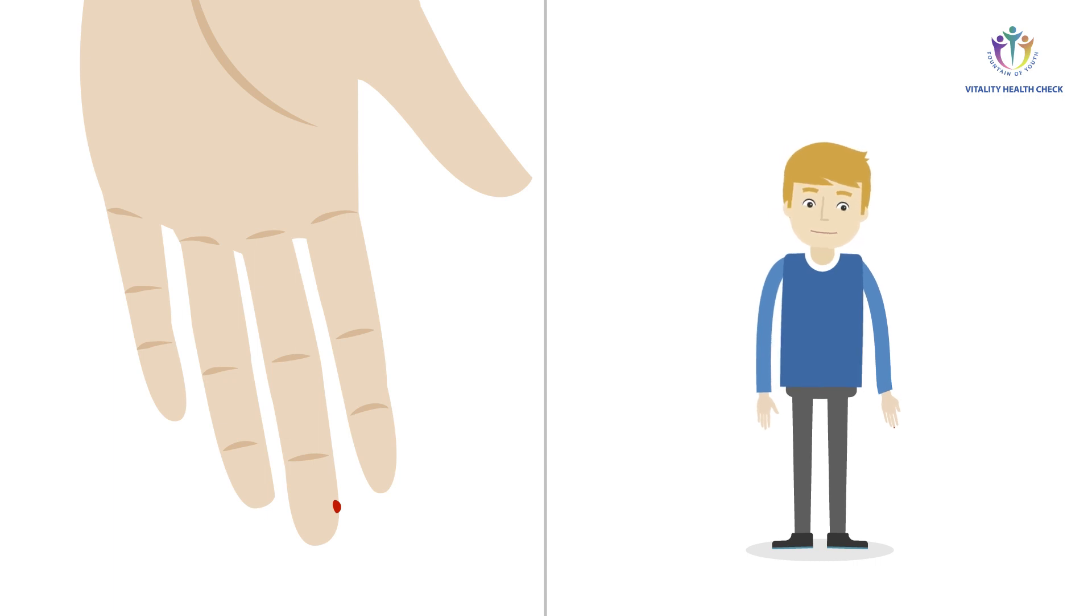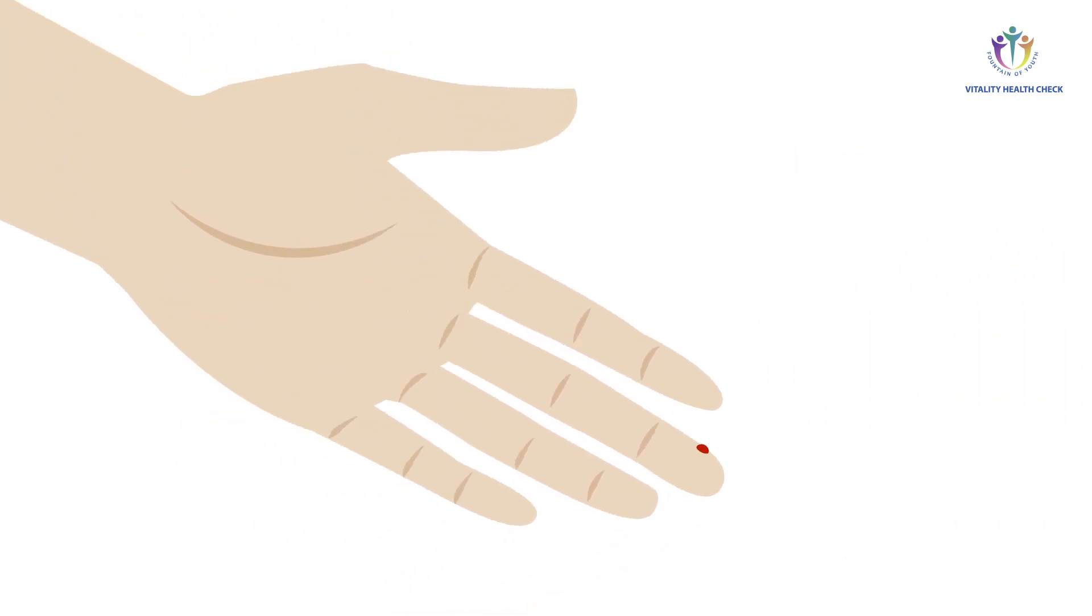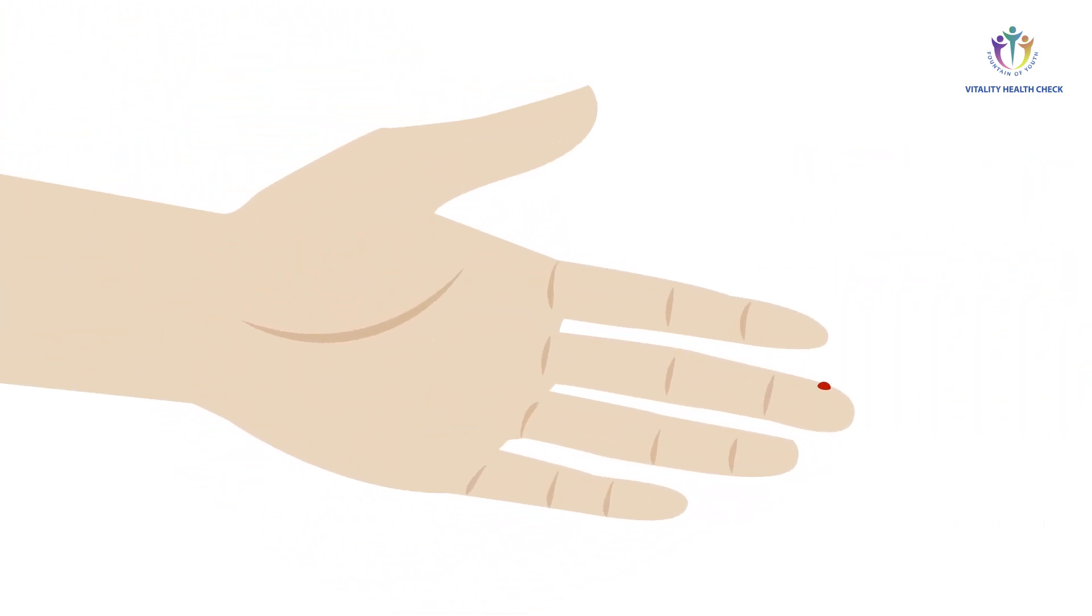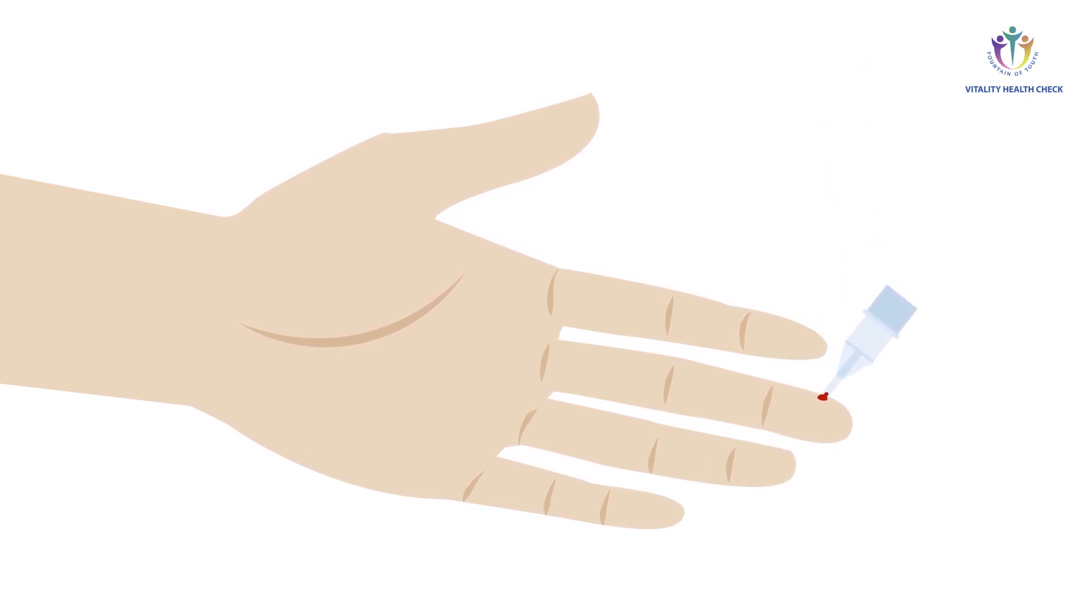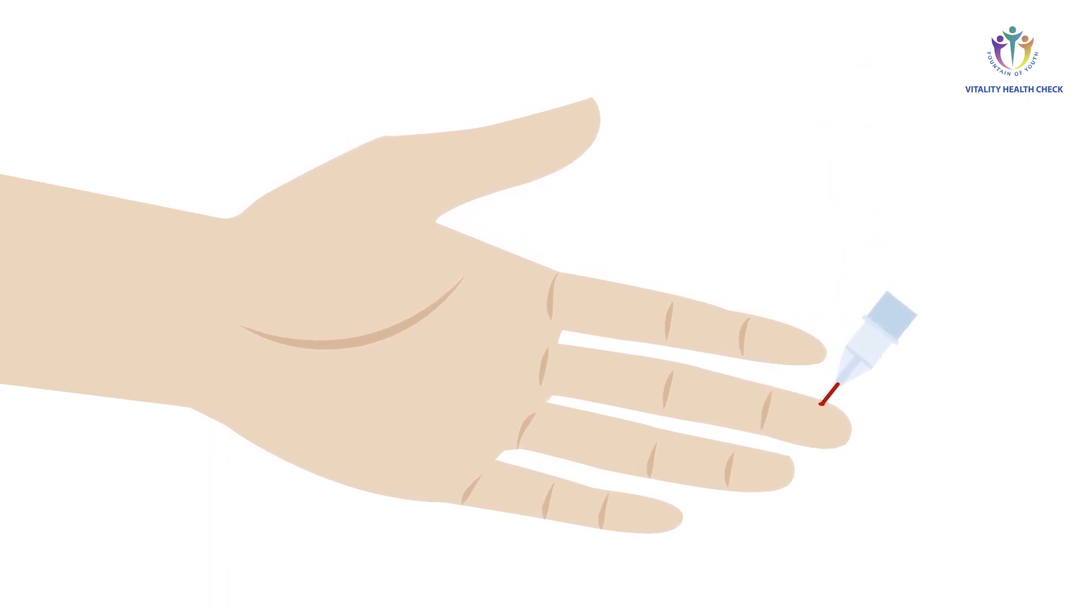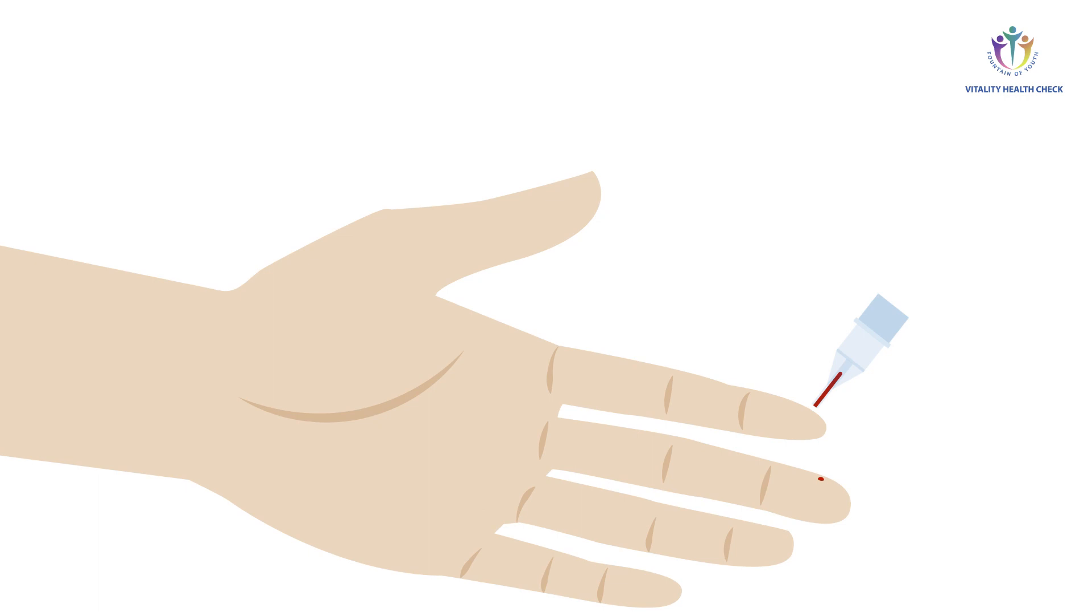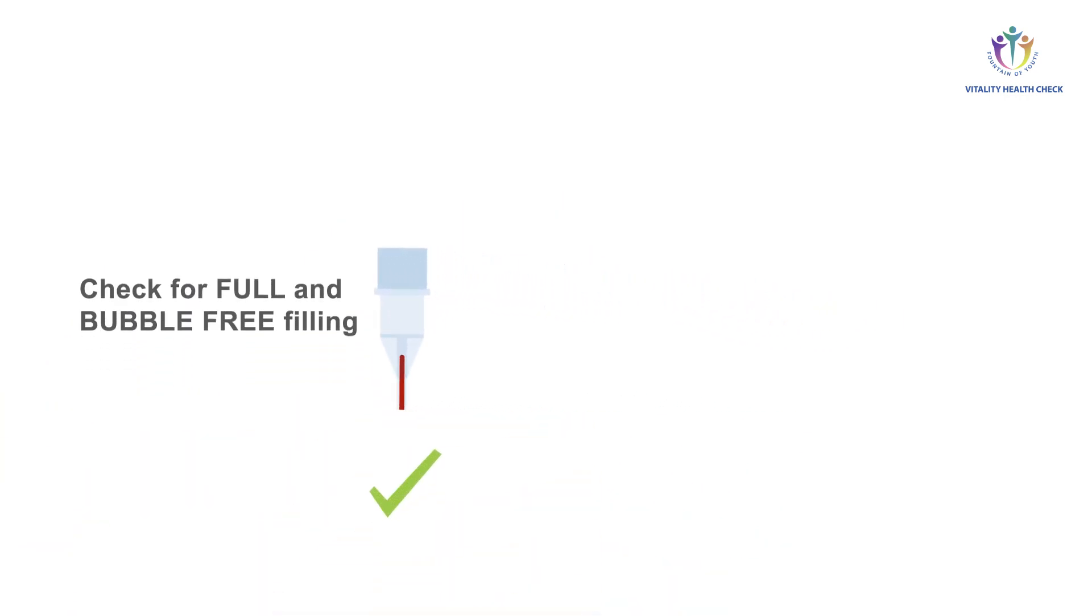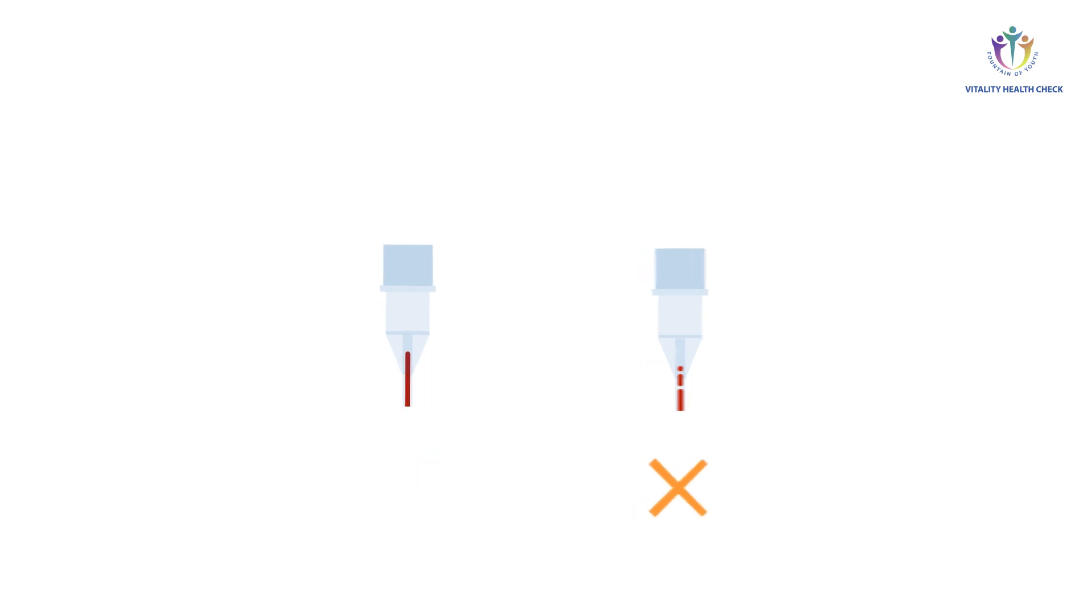Wait until the second blood drop has achieved a size of about two to three millimeters to ensure the capillary of the blood collector can be filled in one go. Make sure not to squeeze or milk the finger as this might cause dilution of vitamin D in the sample by leaking tissue fluid. Touch the blood drop slightly oblique with the capillary of the blood collector so that it fills in one go. Check for full and bubble-free filling of the capillary in order to ensure the sample volume is exactly correct.